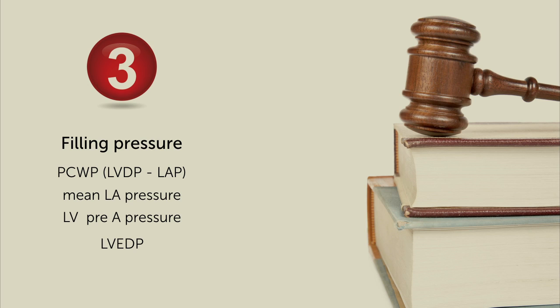The third point, do you want to comment on that, maybe about the issue of filling pressures? Yeah, I think that's what the patient's dyspnea is causing. That's relevant. Especially you have to separate the parameters, what you are going to measure: early diastolic pressures or late diastolic pressures. You have to know what you're going to measure with each parameter to assess, for example, whether there is left atrial pressure enhancement, and then, because of the left atrial pressure, the patient has his dyspnea. So you have to know what you're going to measure.